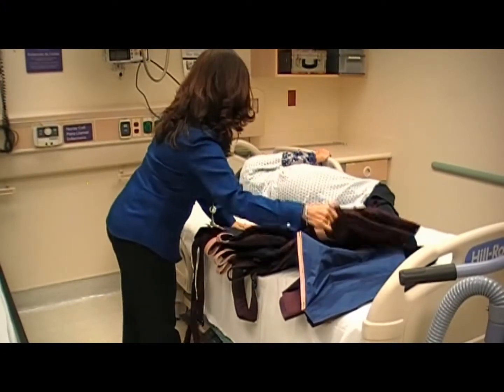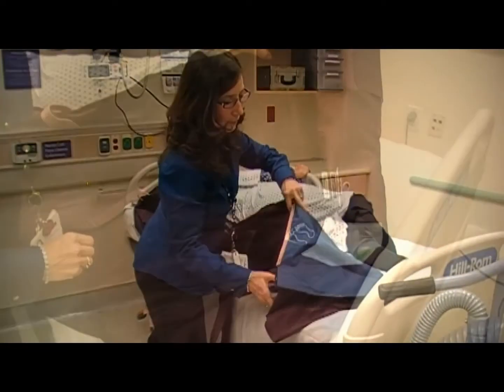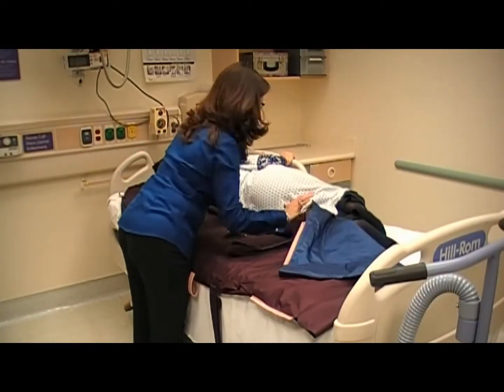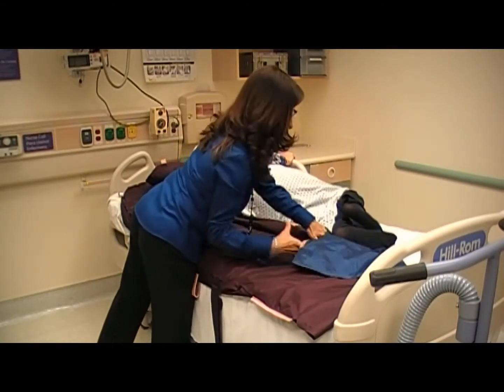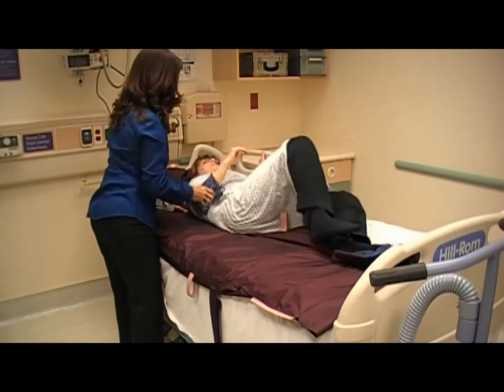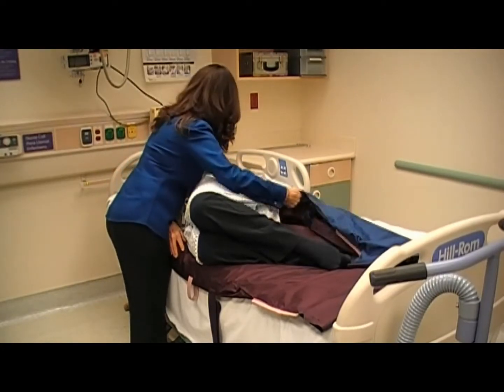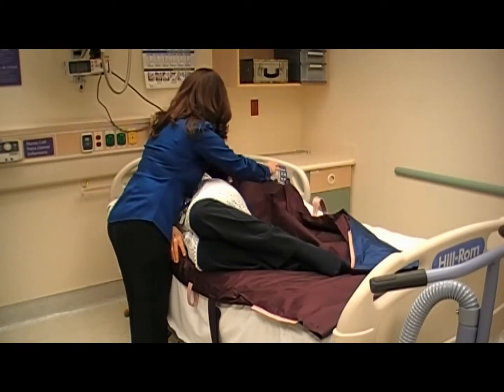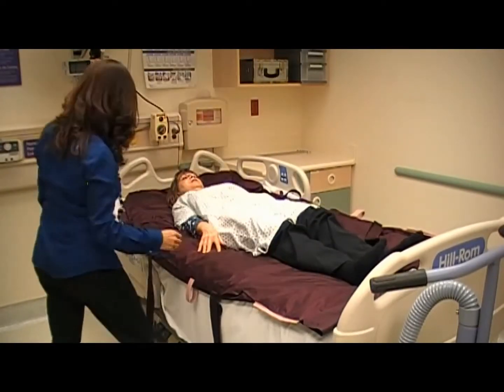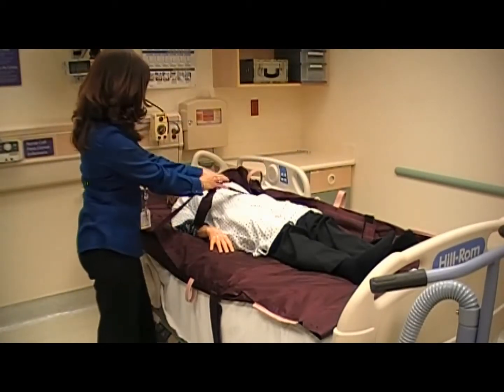Use the roll technique to place the mat under the patient. Make sure the foot end of the mattress is at the end of the bed. Center the patient on the mat. Secure the patient using restraining straps.